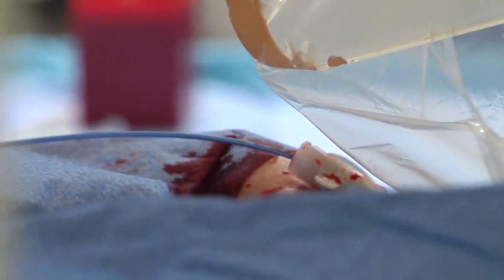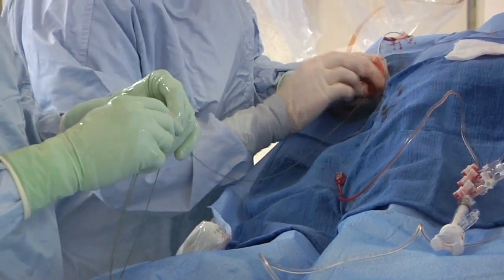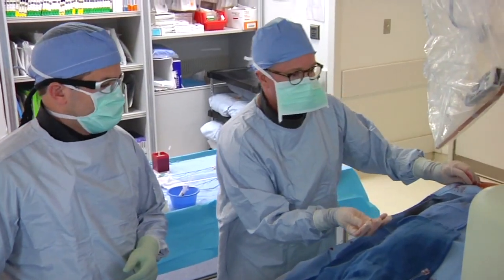Any invasive procedure carries some risk of bleeding. Using the radial artery rather than the femoral artery reduces the risk of bleeding from the puncture site, particularly in patients who are obese or require blood thinning agents.